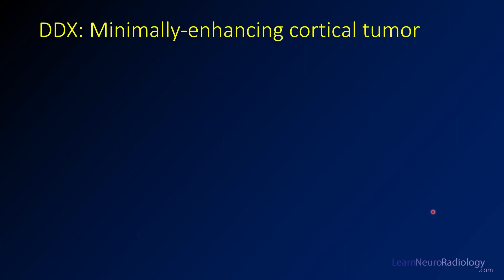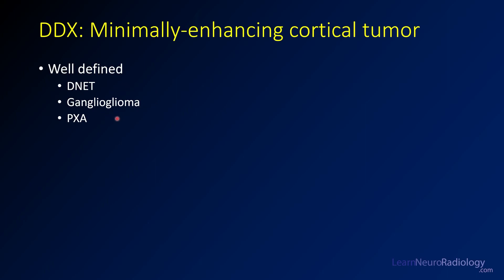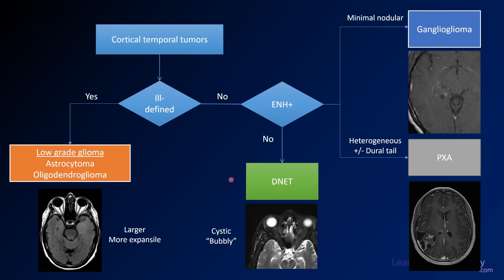Here we have to think a little bit about our differential for minimally enhancing cortical tumors. We think about whether they're well-defined — well-defined lesions include DNETs, gangliogliomas, and PXAs. If they're ill-defined, we want to think about low- and intermediate-grade gliomas, depending on how much enhancement we're seeing. We've seen this chart before — this is an approach to cortico-temporal tumors.